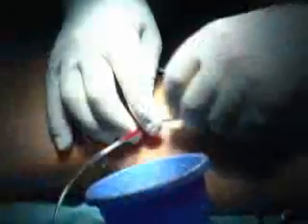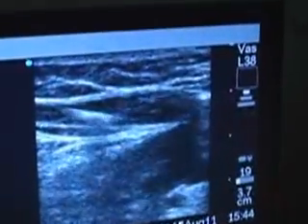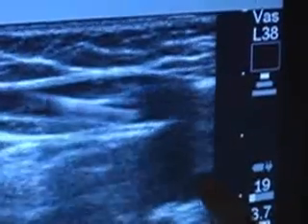With this we use radio frequency energy. We put this cannula — this little hose — up inside the vein. We can either make it through a needle hole or through a tiny cut down that's about the size of my little finger, about four millimeters. And we thread this cannula up through the vein. Once we get to where we want proper placement we look at it with the ultrasound and we open up this little antenna array.